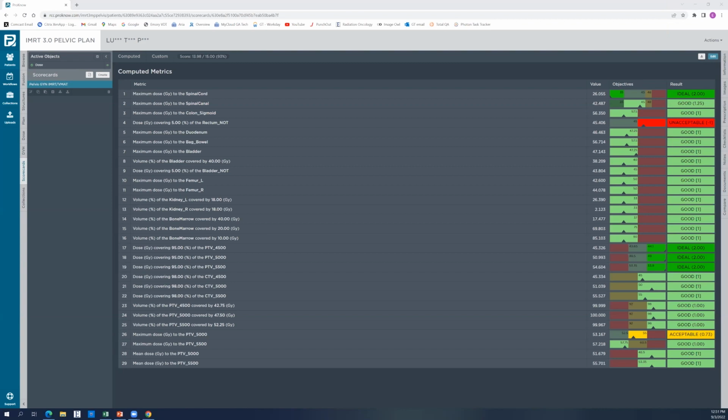Yeah, hello. The idea is, is there any difference in the contouring when the physician does the contouring for VMAT or for 3D specifically? For example, in a head and neck case. There shouldn't be. If you're contouring your PTVs or your OARs, they should be the same from one plan to the next. So the medical physicist has to decide which technique should be applied.